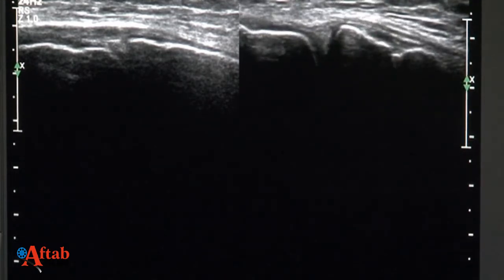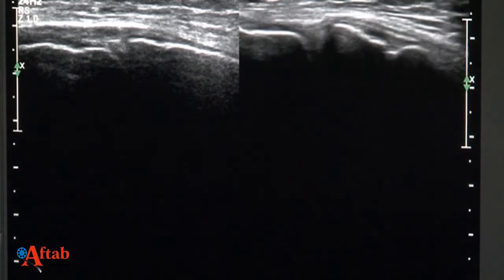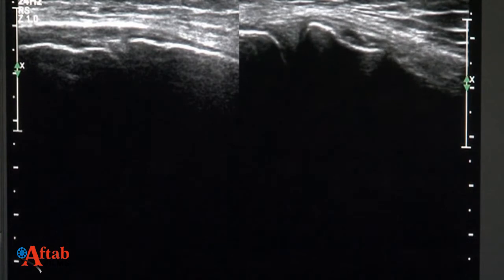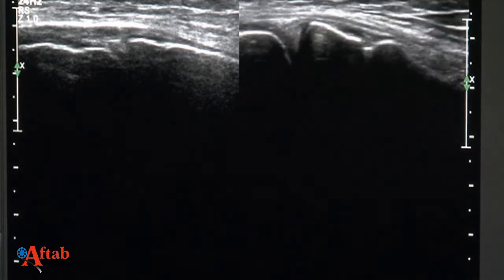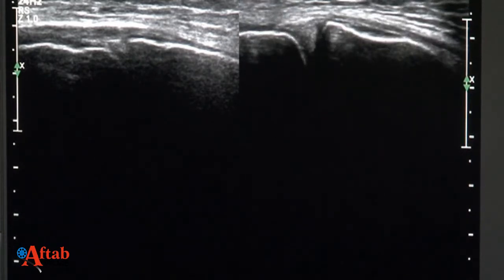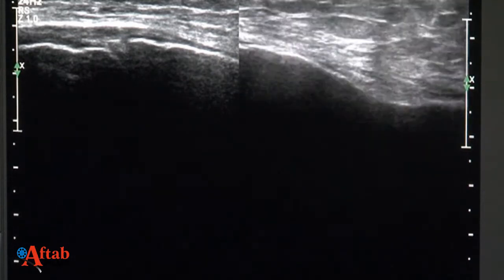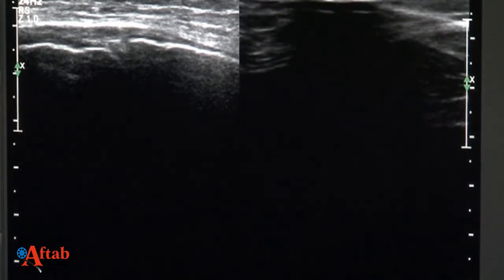Dr. Pippin said, does it look as if there is an osteochondral body that is coming out of the tibial right here? That's the femoral condyle, sir. Yeah. So I'm at the tibial end now, where there is an attachment of the medial collateral ligament. Does it seem that there is a little avulsion chip coming from there? Not that. Irregularity. Because this is just the thickening of the medial collateral ligament, so I'm not truly convinced about that one.